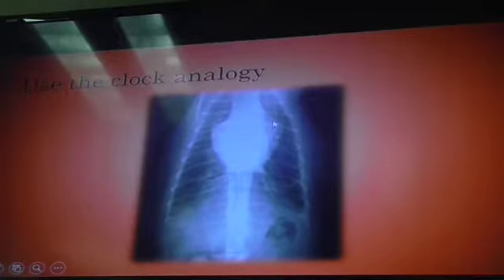So bulges should have been seen here. You guys see this protruding outward? And this one protruding outward. If you had to take a guess, which chambers or which part of the heart is that? Yes, so you have biatrial enlargement. What do you guys know about biatrial enlargement, especially if I told you this was a cat?